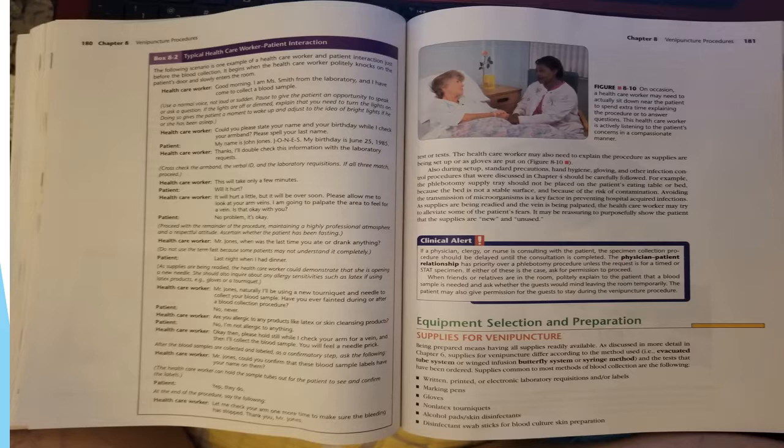Clinical alert. If a physician, clergy, or nurse is consulting with a patient, the specimen collection procedure should be delayed until the consultation is complete. The physician-patient relationship has priority over the phlebotomy procedure unless the request is for a timed or stat specimen. If either of these is the case, ask for permission to proceed.